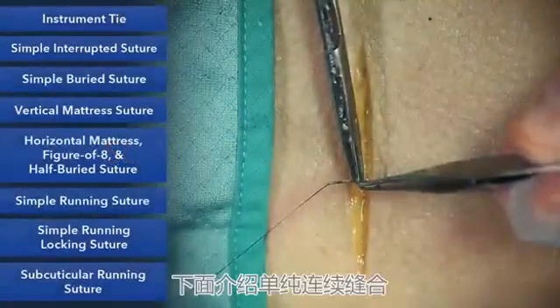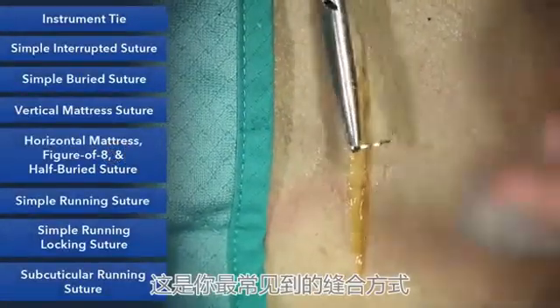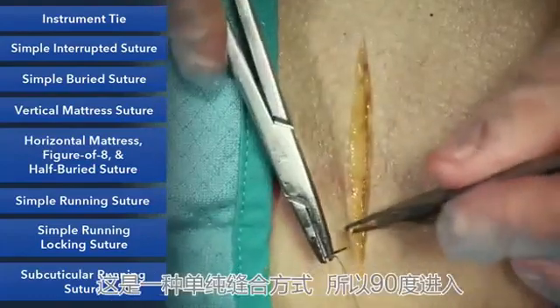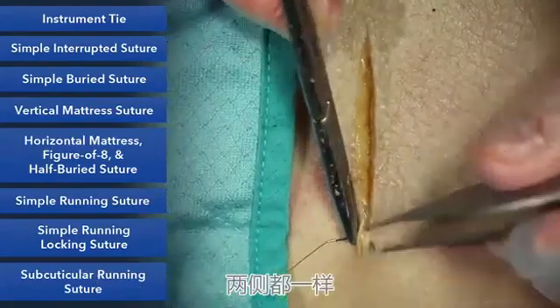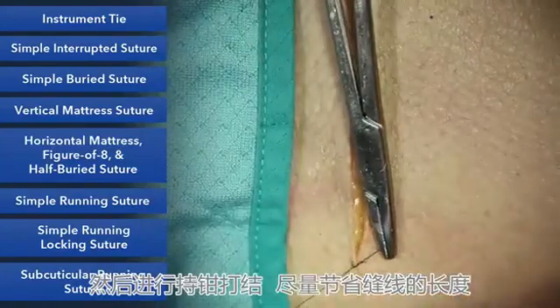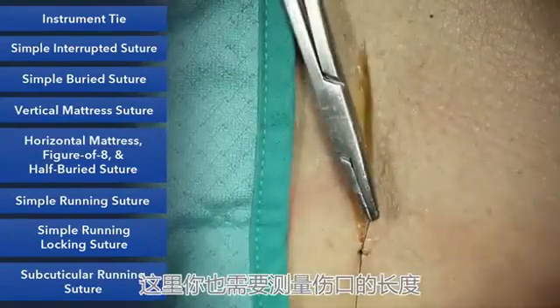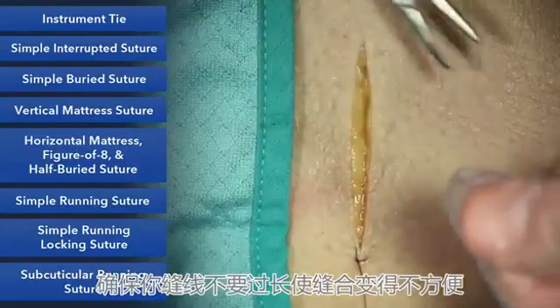Our next stitch is a simple running suture. This will be the most common suture you'll use to close incisions. It's a simple suture, so again 90 degrees and 90 degrees, same bites on both sides. And you'll start with an instrument tie and try to save length on your suture here. You also want to measure the length of your wound and make sure you're not working with such a long suture that it becomes unruly.